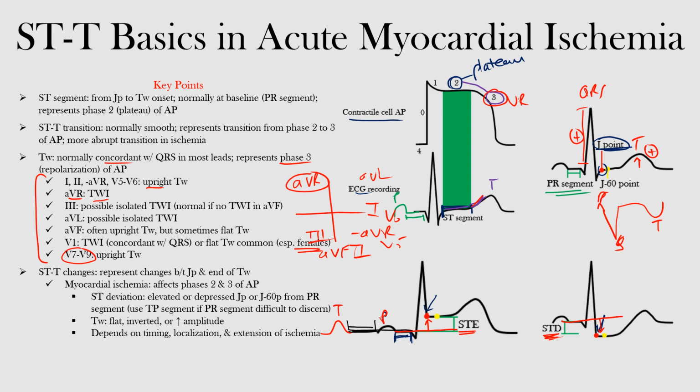Now, what we use today is the PR segment. You'll hear a lot of people say otherwise, but recent studies have suggested that the PR segment should be used, and there's many reasons that we won't get into around that, okay?